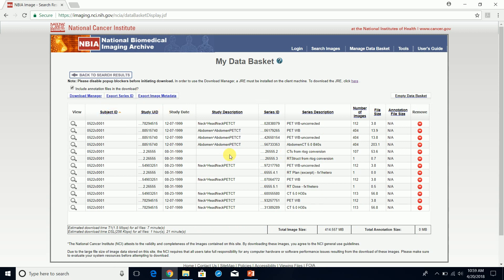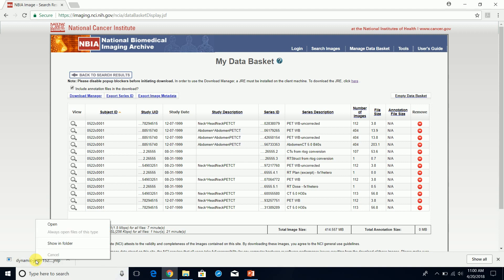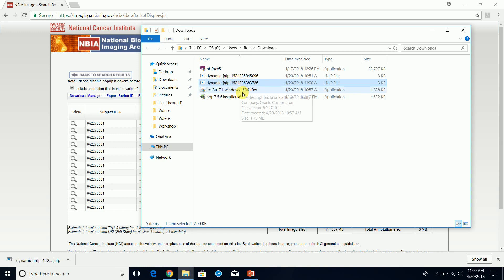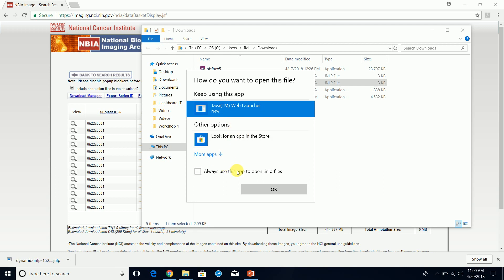We have one study selected — it's 400 megabytes. You can download multiple studies if you want. Now we're going to click on Manage Data Basket, then click on Download Manager. It's going to download the JNLP file. We want to keep it, then show in folder. Let's open it with Java Web Launcher — that's what we want.